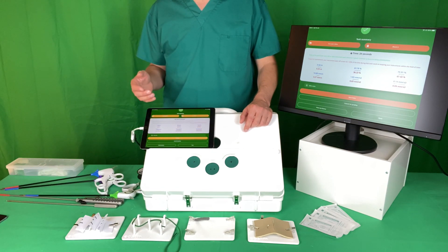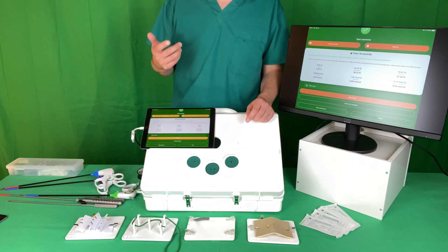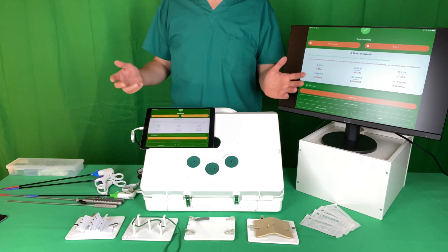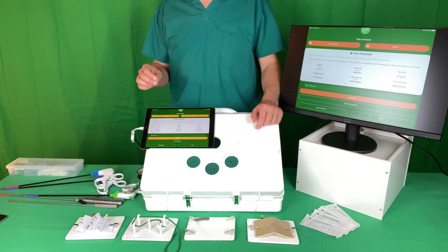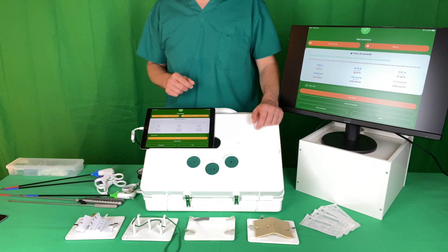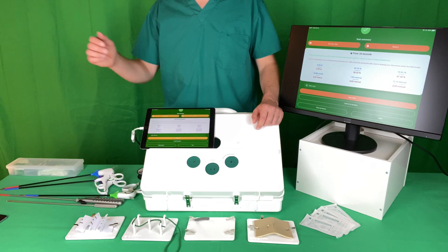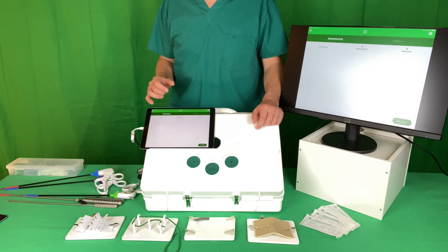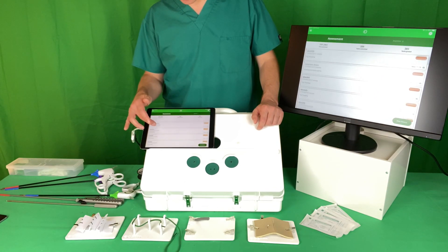If you've done something and you're not quite sure what it was but you felt it was good — say you're doing laparoscopic suturing and it felt like it flowed better than previously and you want to revisit what it was you did — click this button and you can re-watch your video. If you've completed the task in one of the target times as specified in the module when you started, you can click Submit for Grading and that will then be sent off to an assessor.